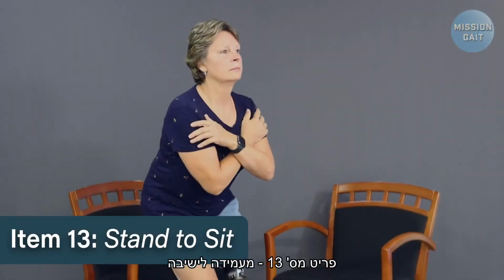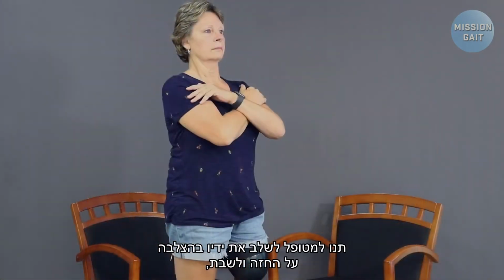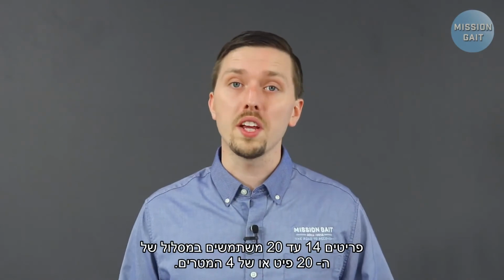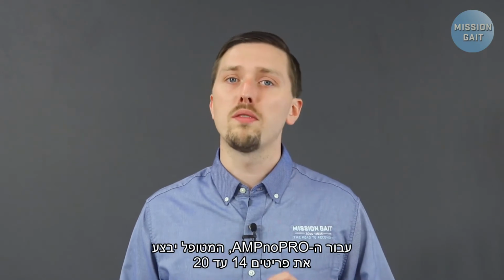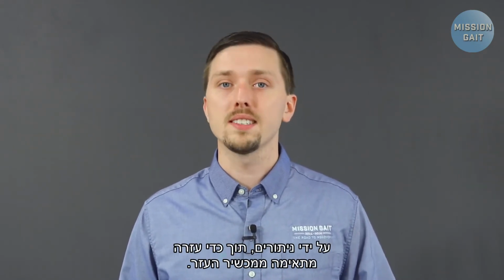Item 13. Stand to sit. Have the patient fold their arms across their chest and sit, using arms or assistive device as necessary. Items 14 through 20 utilize the 12-foot or 4-meter distance. Have the patient sit in the chair at the start of your walkway. For the Amp No Pro, the patient will perform items 14 through 20 by hopping with an appropriate assistive device.